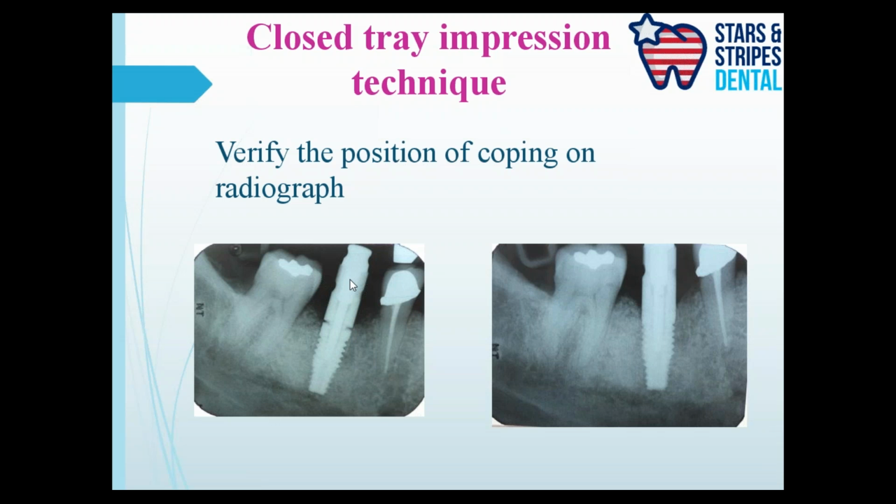It feels tight when I close the screw in the implant and I just take the impression and send it to the lab. What will happen? What will happen is I will record the position at this level. So when my crown comes back, the crown will sit in exactly the same position. No matter how hard you try, the crown will not go down completely on the implant.